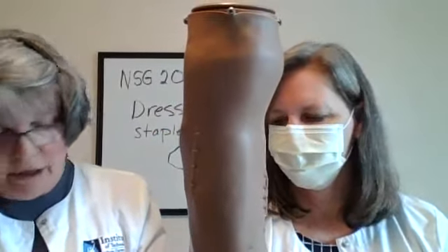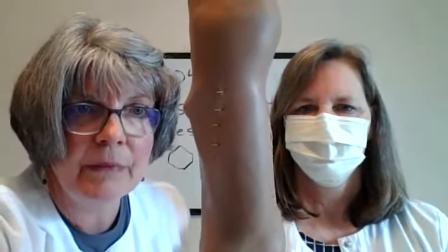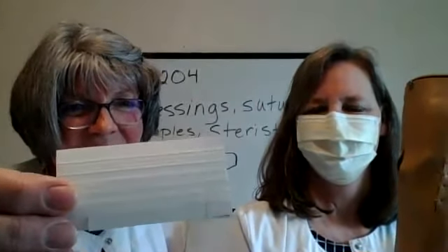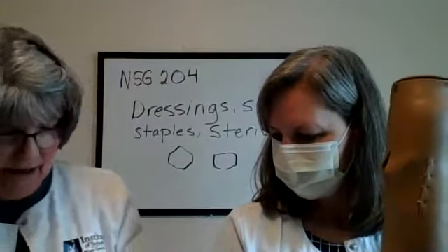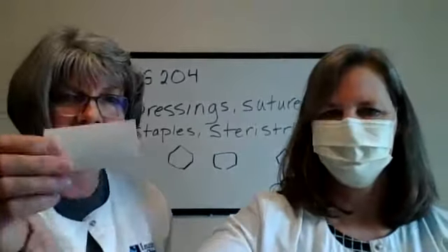And then I'll show you a little trick with Steristrips. It's kind of cool. There are several different sizes. What I have right here. Oh my goodness, I'm really off today. These are 1/4-inch Steristrips. I also have, these are 1/2-inch Steristrips. Like, I tell you, opposite. My brain doesn't want to go that way. Yeah, just show them how you're going to do that right there.